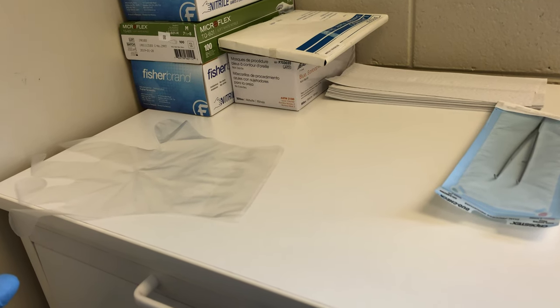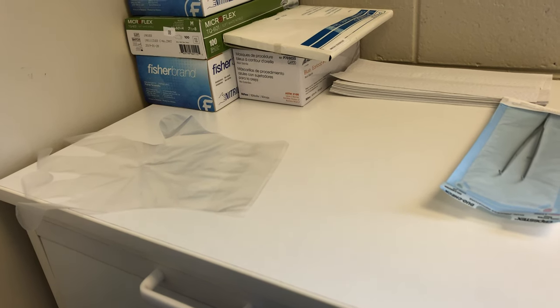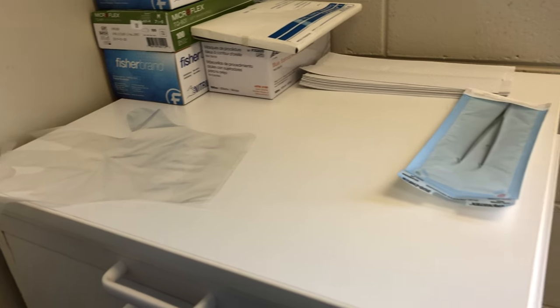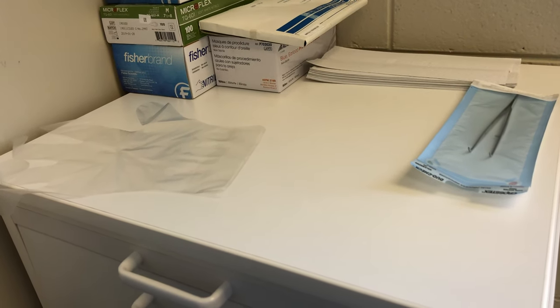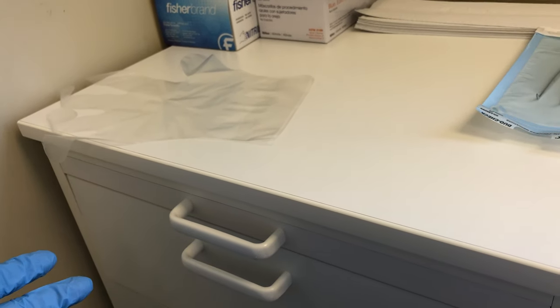When you're working chairside, there will come a time when you realize you forgot an item, ran out of items, or dropped something on the floor and need to replace it quickly. We have to get the new item without contaminating the rest of the stock that we have.